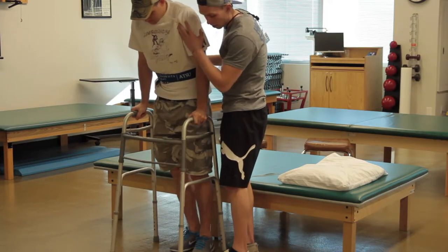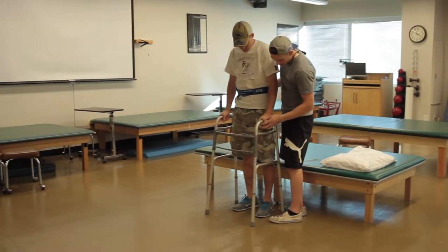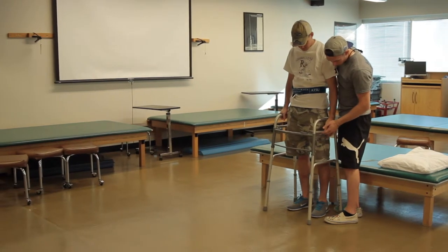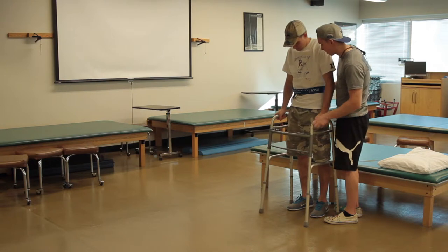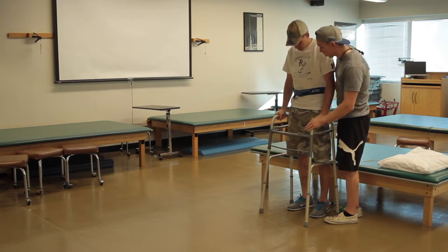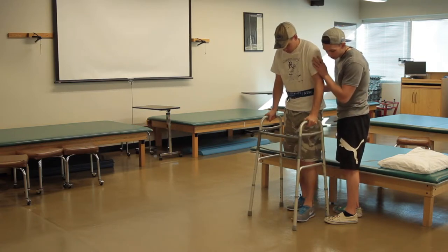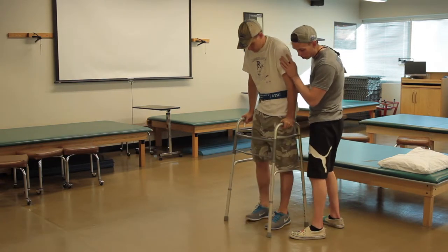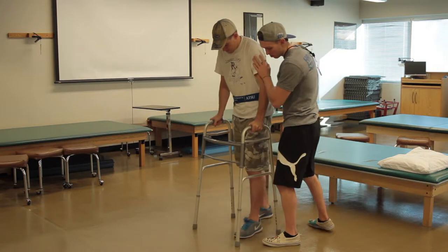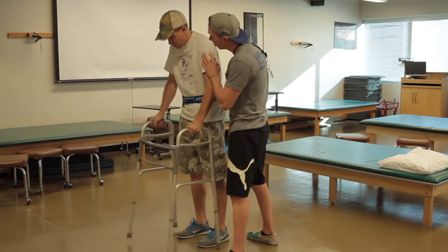Very good, very good. Now that we're here, I'm going to have you dangle this arm to your side. I just want to make sure, okay, that's perfect. Hip height, right at the break of the wrist. Okay, so how the walker is going to work is you're going to go walker first, and then you're going to move this painful involved side next, and then the right. Good. Just that pattern. Walker, left, right. Very good. How does that feel? Great.